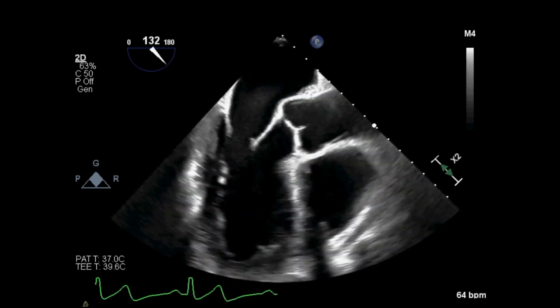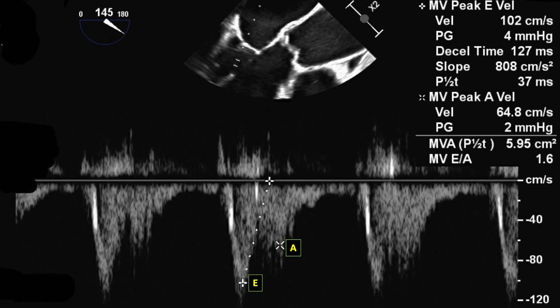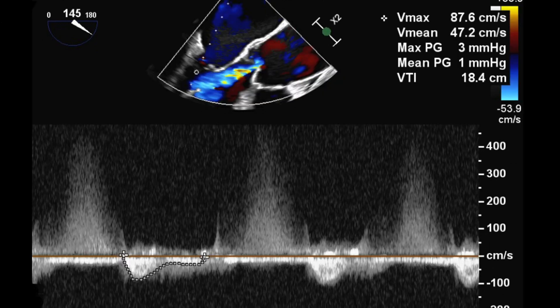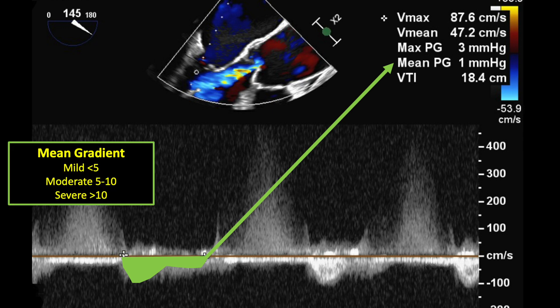I flip to the mid-esophageal long axis view and pulse wave Doppler at the mitral valve leaflet tips to capture the peak E and A wave velocities. This generates the E to A ratio for diastology, and I can measure the deceleration time and pressure halftime of the E wave to estimate the mitral valve area. In the same region, I obtain a transmitral gradient using continuous wave Doppler and trace the inflow below the baseline, which assists in grading degrees of mitral stenosis.